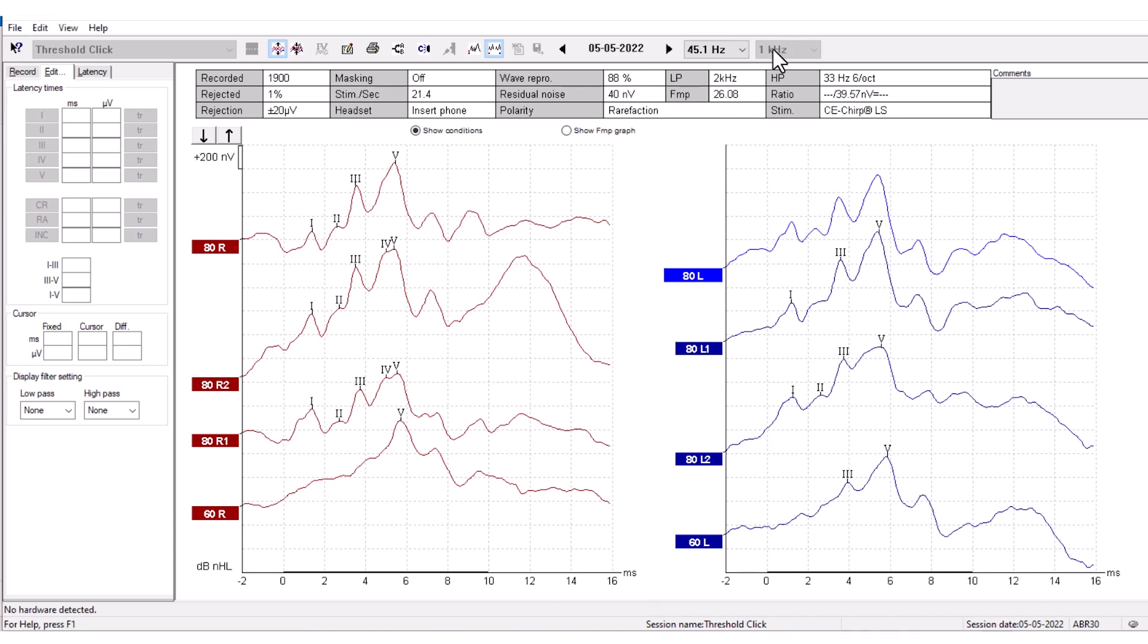You can also change the Stimulus Frequency next to the Stimulus Rate. This gives the option to change between 0.5, 1, 2, and 4 kHz.